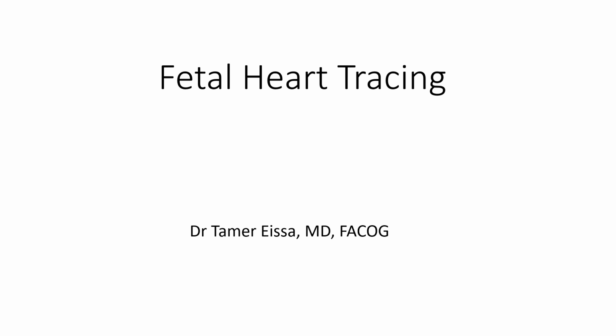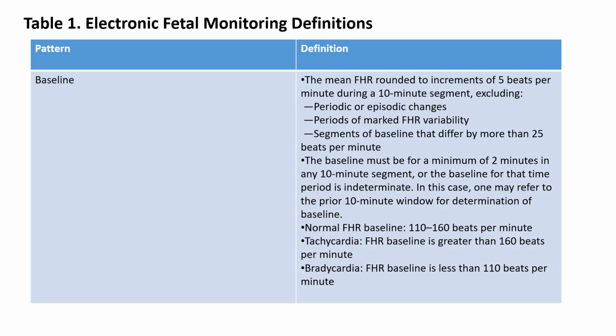I'm going to give you today a presentation about fetal heart tracing and a brief about the partogram. The first thing that we should know about fetal heart tracing is some definitions, and we'll look at some figures and pictures to see what I'm talking about. The first thing is going to be the baseline. The baseline of the fetal heart is the rounding to increments of 5 beats per minute during a 10-minute segment.